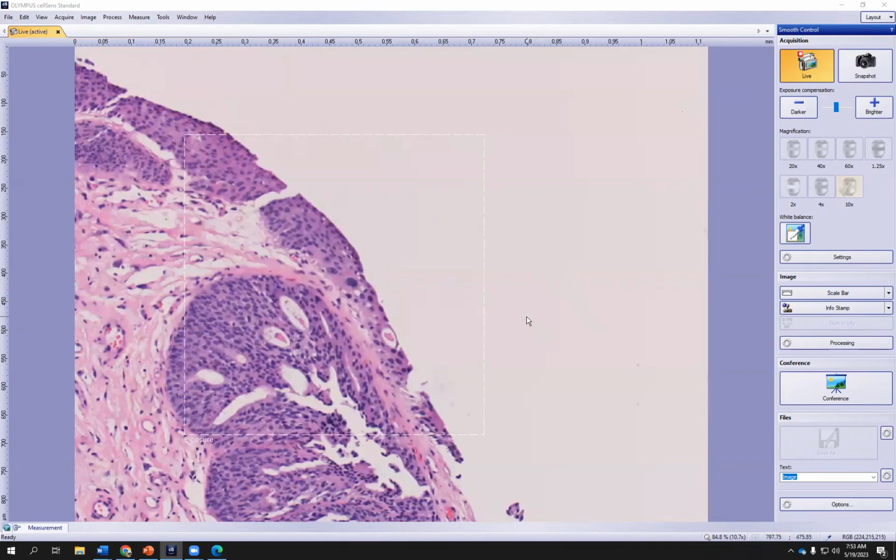So that happens because sometimes due to tangential sectioning, it appears as if the umbrella cells are in the center of the cell layer rather than at the top. So one has to be aware of that feature.